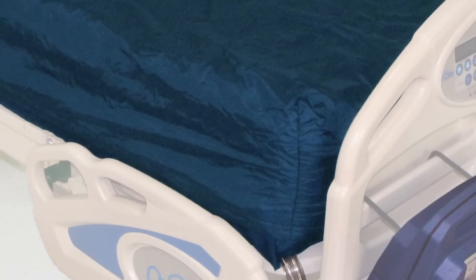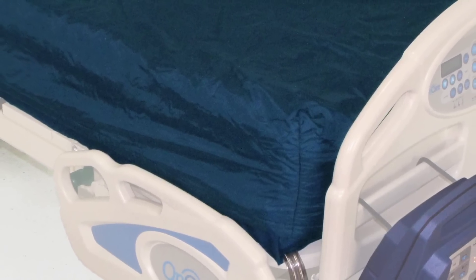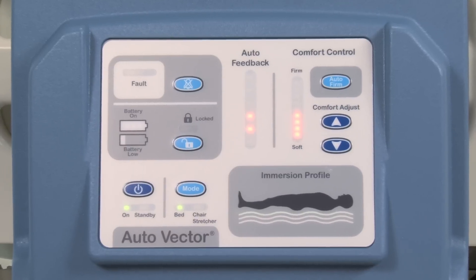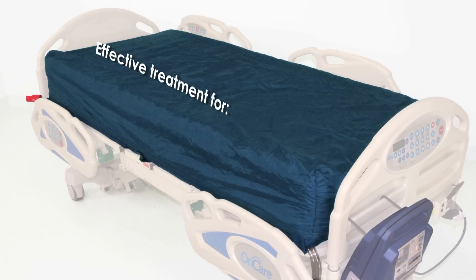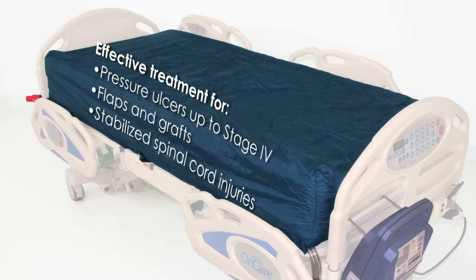In summary, the Dolphin provides advanced fluid immersion simulation with easy-to-operate controls. The Dolphin is highly effective for preventing and treating pressure ulcers up to stage 4, treating patients with flaps and grafts, and for treating patients with stabilized spinal injuries.